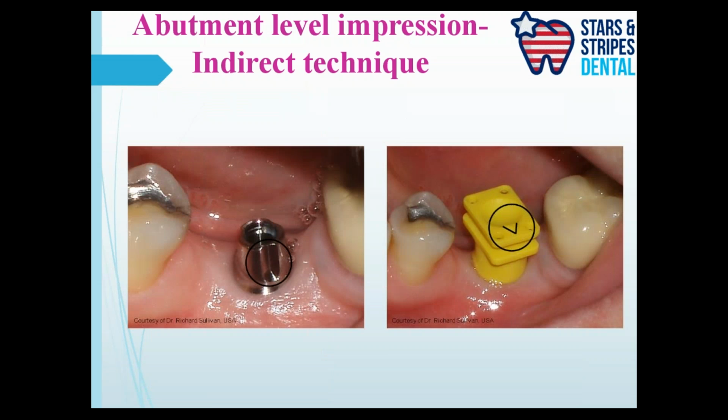Then you put something called a basket. That's why it's called a snappy abutment, because this basket that is provided snaps onto the abutment. As you see, there's a kind of niche or ditch given on the abutment, and the same corresponds on the plastic basket.